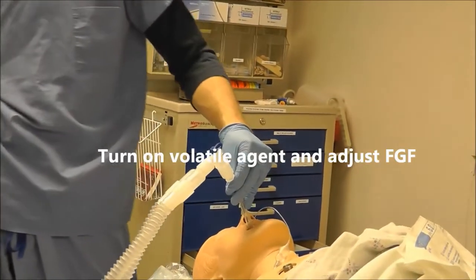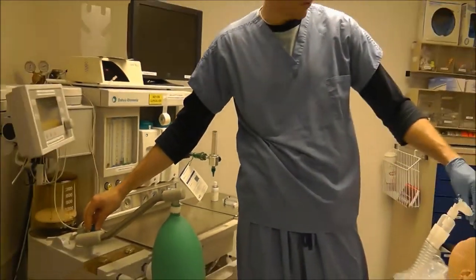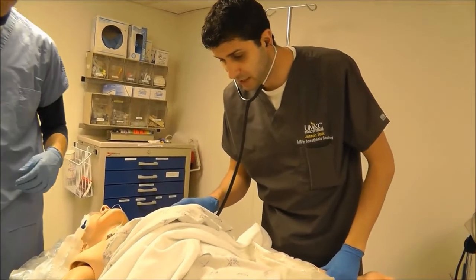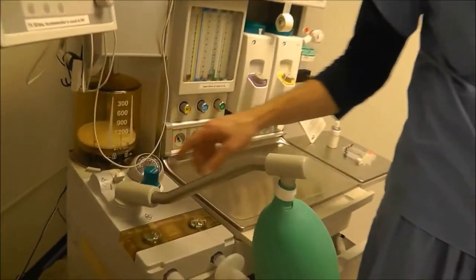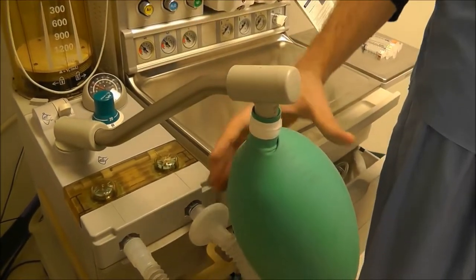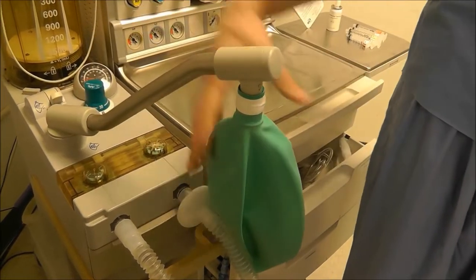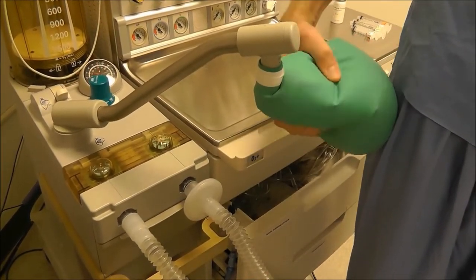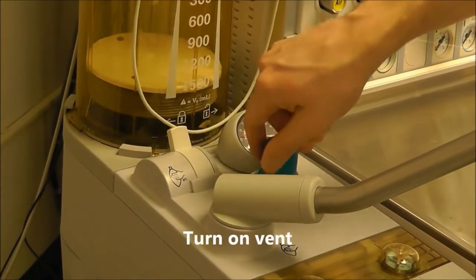and then I'm going to turn on sevoflurane because I want the patient to stay asleep, and then it's time to check for breath sounds. Okay. When I'm checking for breath sounds, I want to make sure that I'm pressing down firmly. And then come over here. What I'm supposed to be doing is I make sure that I go to bag mode, turn my APL valve closed, and squeeze hard and fast so that I can hear him as best as I can. After we've seen that breath sounds are bilateral, we'll go ahead and place on the vent.